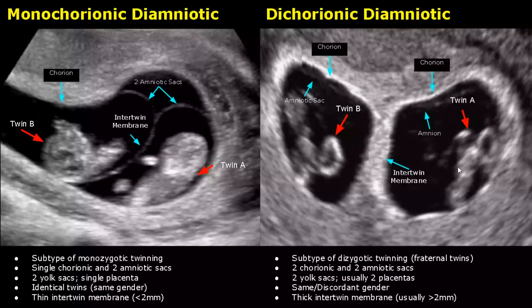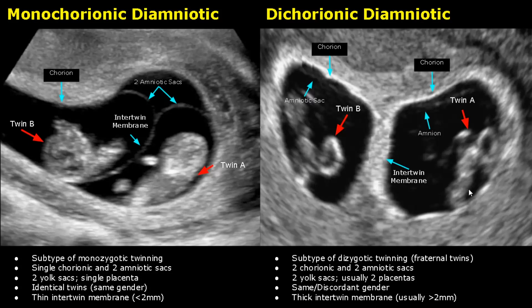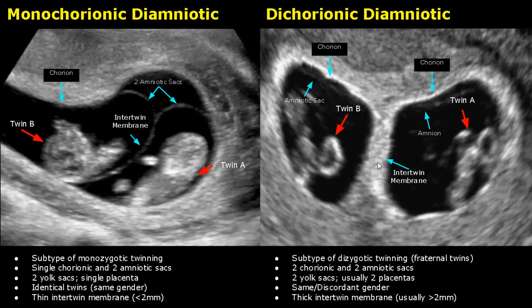In dizygotic twins, two eggs are fertilized by two different sperm, and these twins will be fraternal twins. Dichorionic-diamniotic is its subtype, in which there will be two chorionic and two amniotic sacs. They will have two yolk sacs and usually two placentas as well. The twins' gender can either be the same or discordant — one twin can be female and the other male. The intertwin membrane will be thick because it is made up of two layers of chorion and two layers of amnion, much thicker than in monochorionic-diamniotic twins.